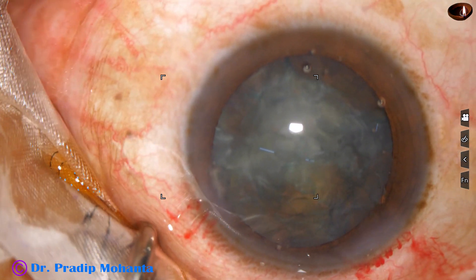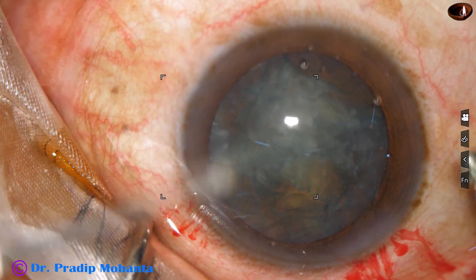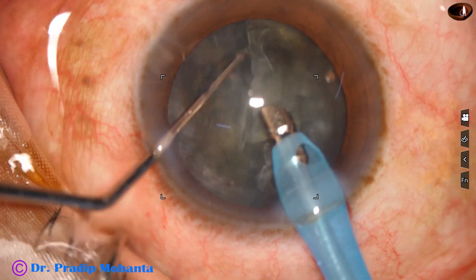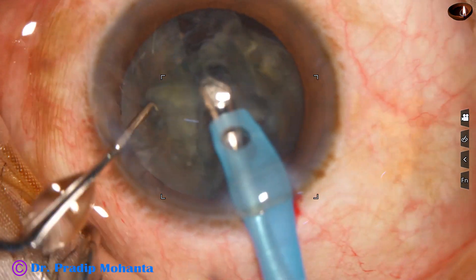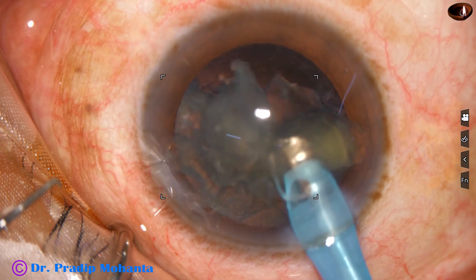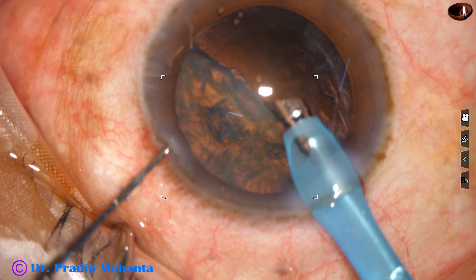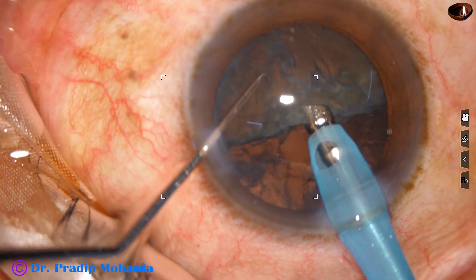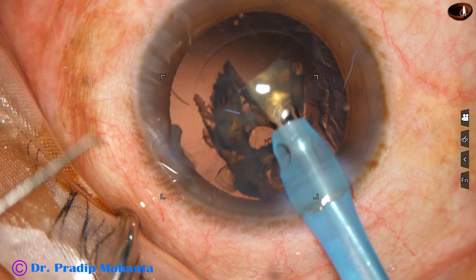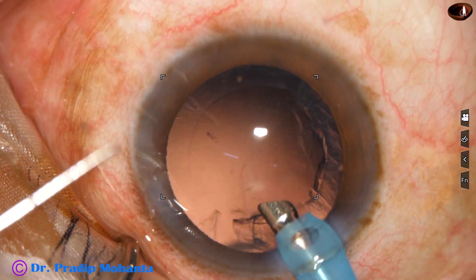Now some visco is injected. The feco needle is now introduced with its bevel down. This is a small chopper which I use, which has been designed by me, and I pick up the fragments and emulsify. It is so easy now to pick up each nuclear piece and emulsify. This hemi-nucleus is pierced in this way and it is emulsified. Most of the time the chopper is out and emulsification is carried out single-handedly so that followability of the pieces is good.